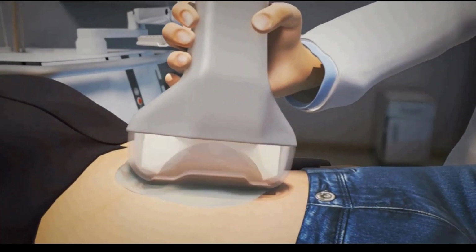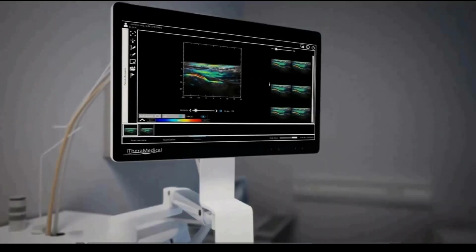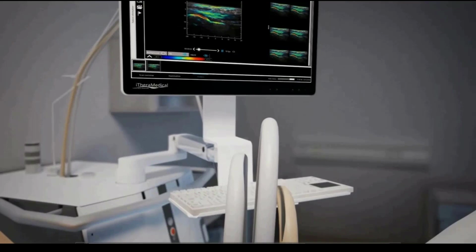You can then translate the probe. In any case, in the handheld case, we're using an array of transducers, a hemispherical array that might have something like 130 degrees. In the animal case, we would have a bit more coverage, a 270 degree array, and other applications may use more or less detectors or different shapes, and I'll get into that a bit later.